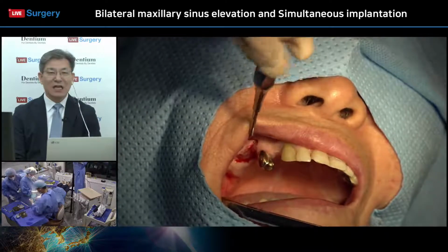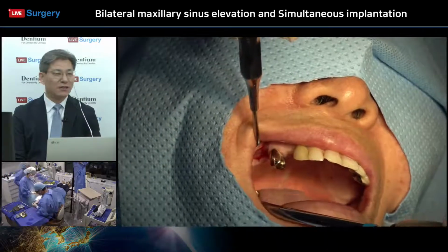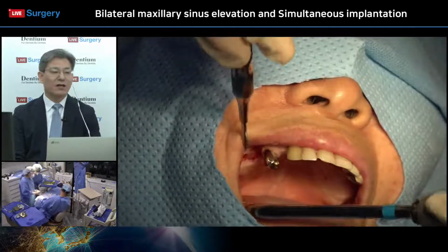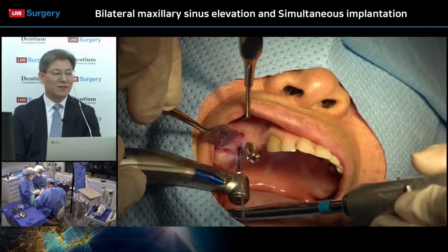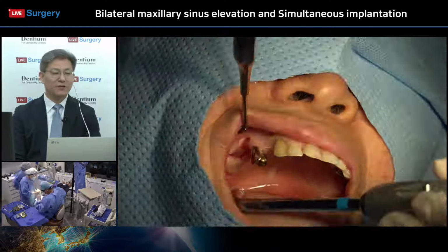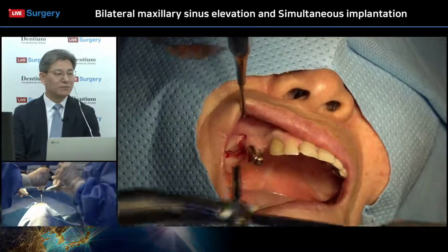These areas need two implantations, actually, number 16 and number 17. But unfortunately, the patient asked, and Dr. Chung decided on only one implantation for this patient. Okay, so 5.0 by 9mm? Bone level.